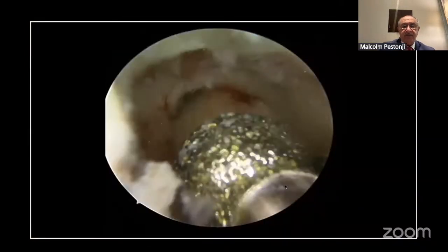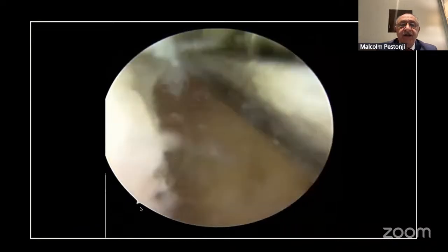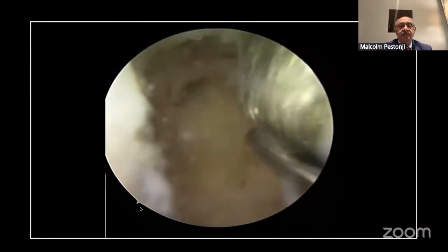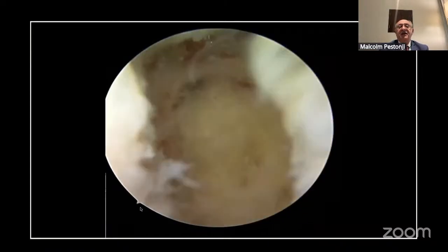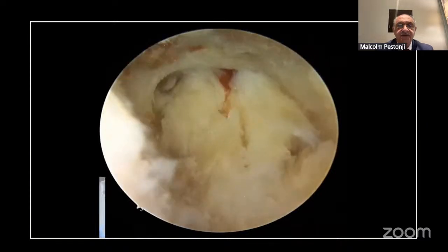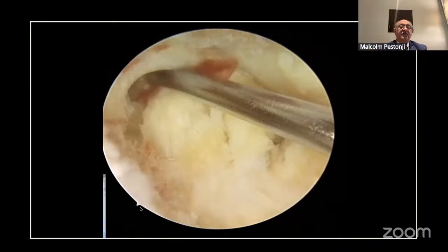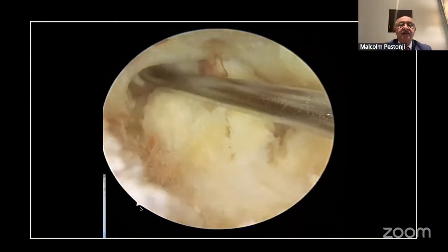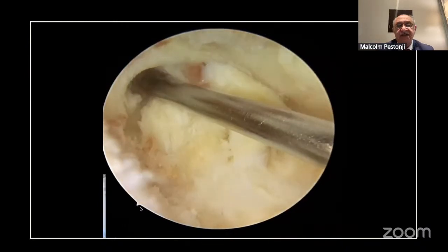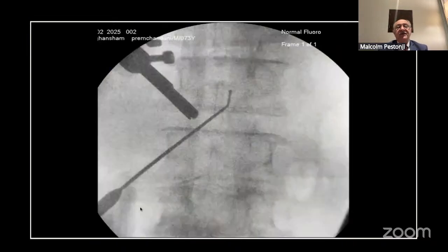So now we are going to play my first video. And you can see me burring underneath the lamina. I don't think, my dear Hussam, that you can go ahead and do this with your tubes. And you can see how wonderfully we are doing that. We have a hook going right through into the previously decompressed L1-2 level. And we will be removing this complete flavum. Here you can see the intraoperative imaging.